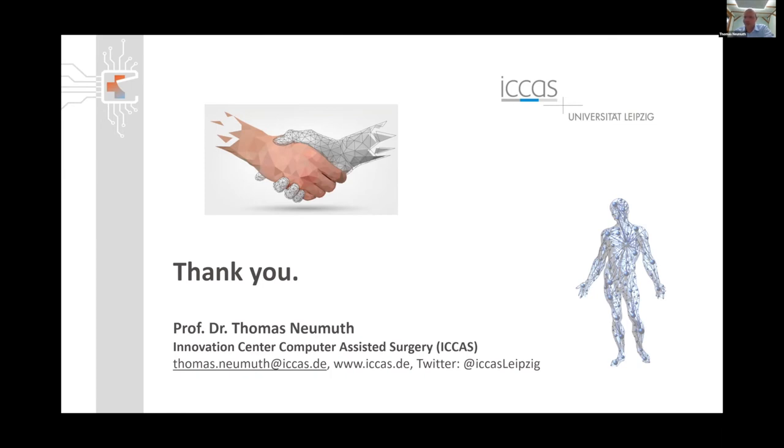Not yet. Maybe it will change sometime with the self-driving cars, but not yet. And it's the same situation with the operating room. The sensors detect the current state of the procedure. They calculate what will happen next, but it doesn't force the surgeon to perform specific work steps, because this would also change some very essential requirements for this technology, because then the technology providers would take responsibility for the medical treatment.